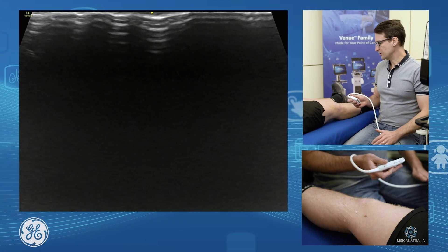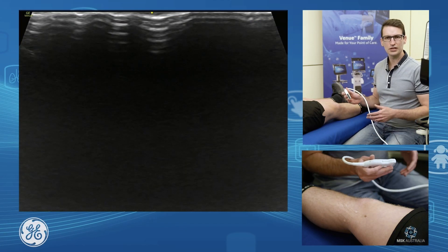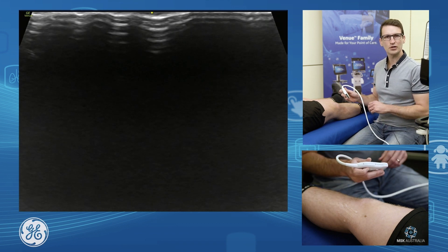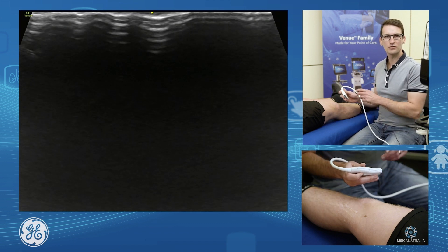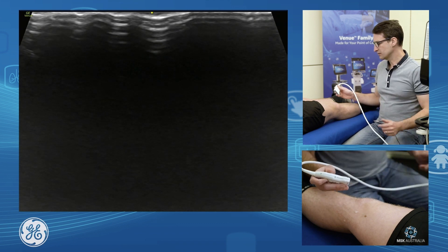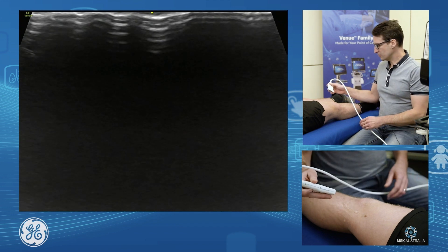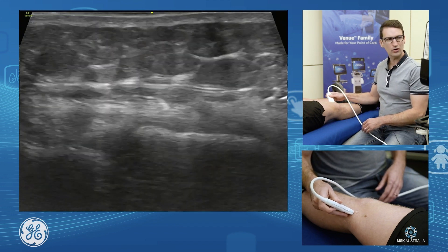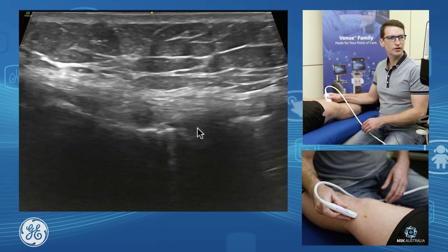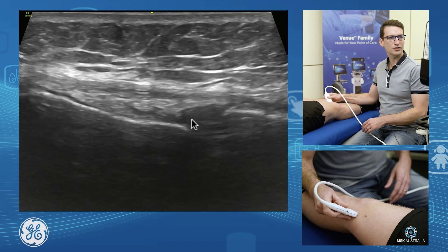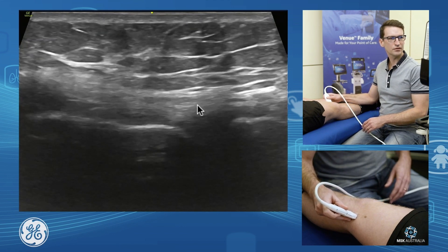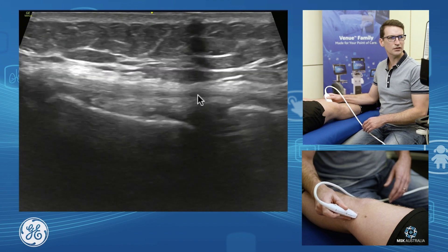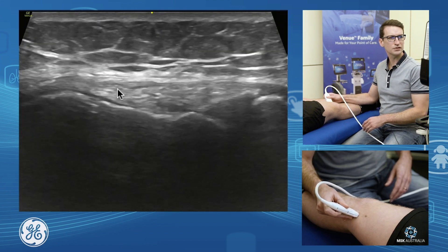I'm going to discuss the medial knee and our medial collateral ligament. The medial collateral ligament runs from our medial femoral condyle down to our proximal tibia. To assess it, we go in the coronal plane onto the edge of the knee joint, find our knee joint, and as we scan towards and away from the bed we will see our ligament — here it is here.